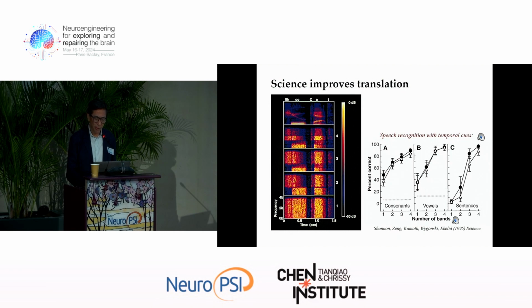I'll let you hear a simulation, which simulates one channel, we call it vocoded speech. And of course, you can see it's 0% open set recognition. I'll say some words and count numbers. You can watch my lips. I hope it's not too loud. Let's give it a try.